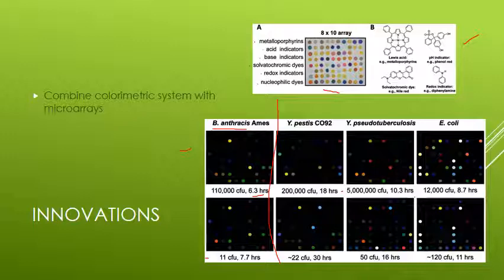How cool would it be to know, okay, this bottle's positive, but I already know that it's just a diphtheroid. I'm not going to freak out about it. I'll let the doctor know right away, okay, it's positive, but it's a diphtheroid. You might not really have to worry about it.